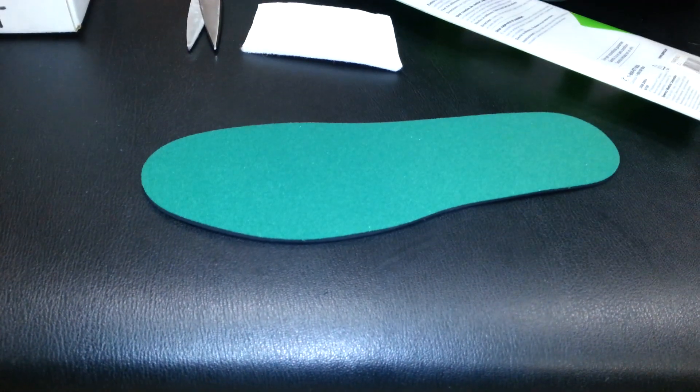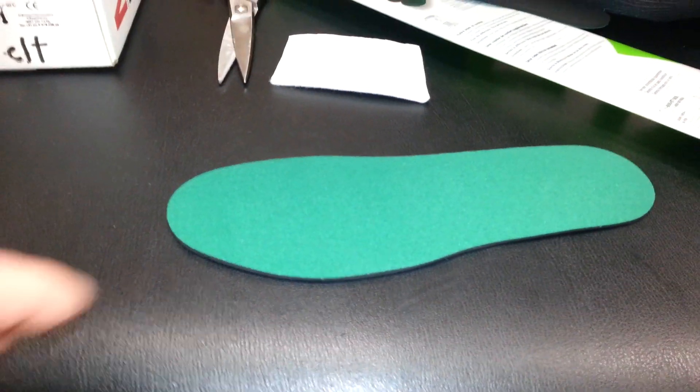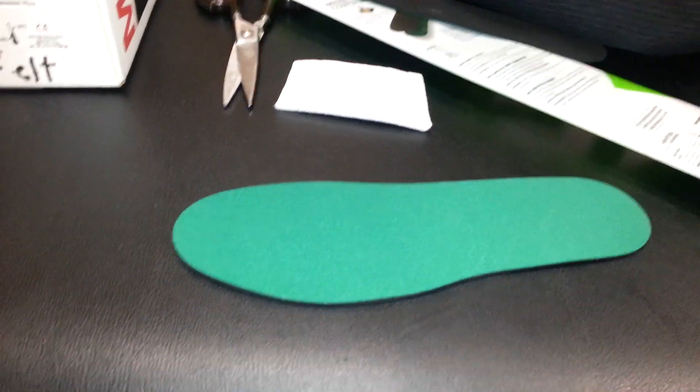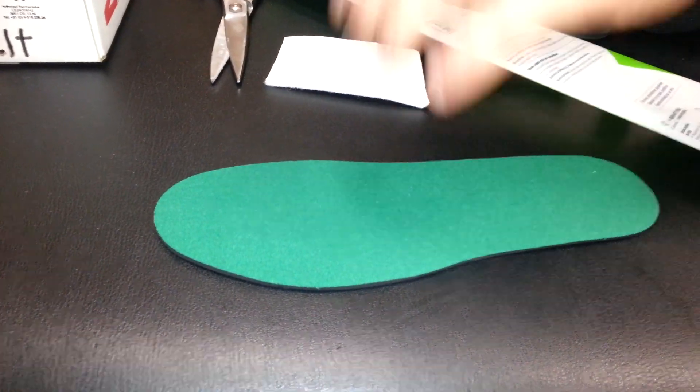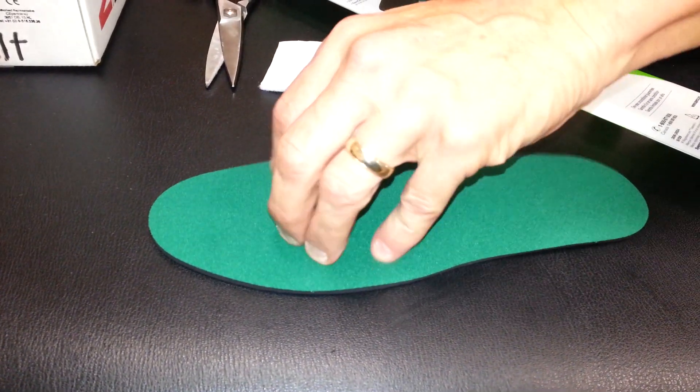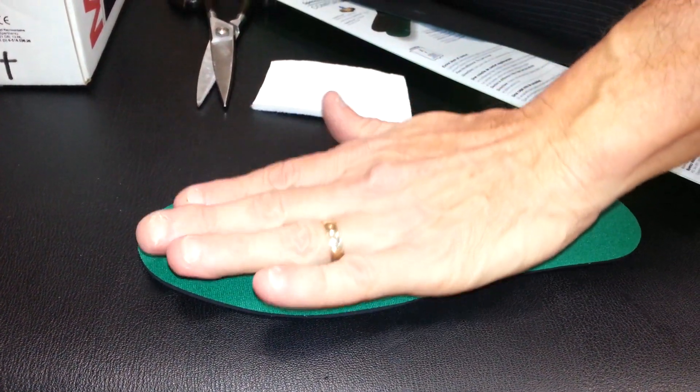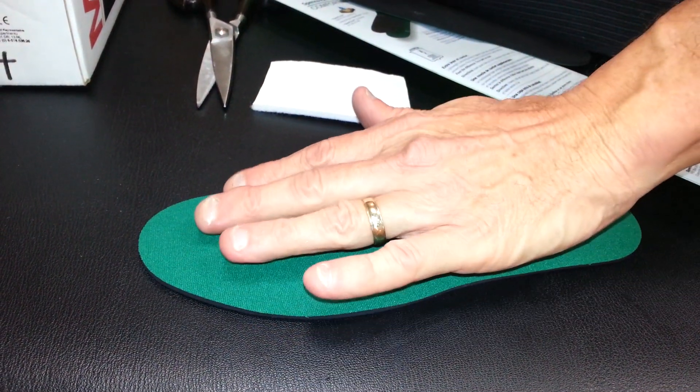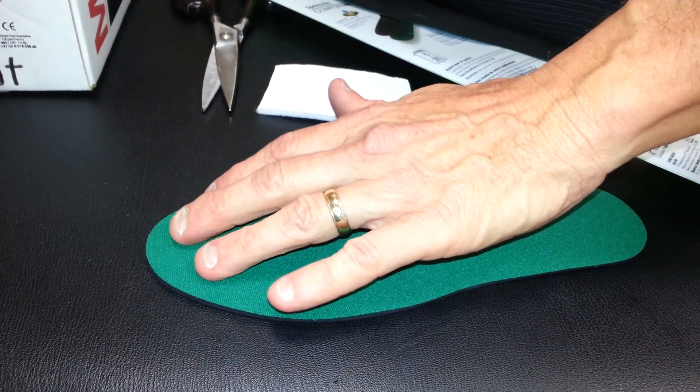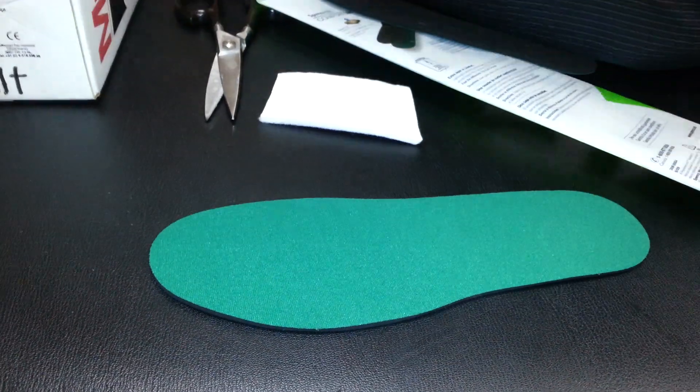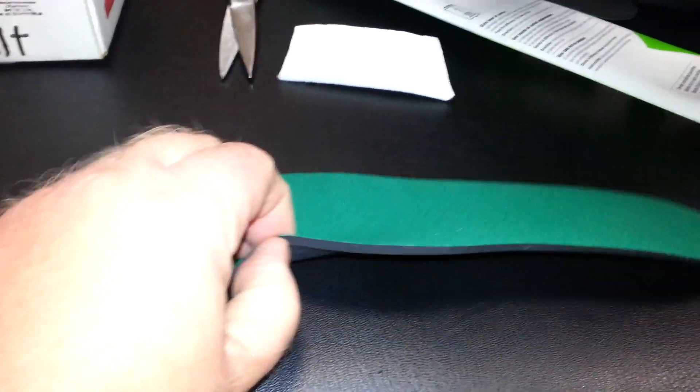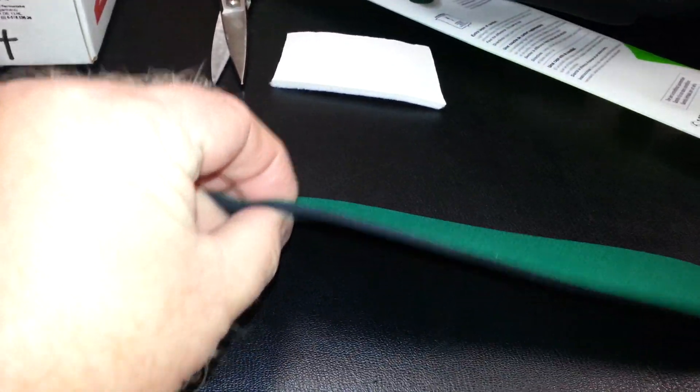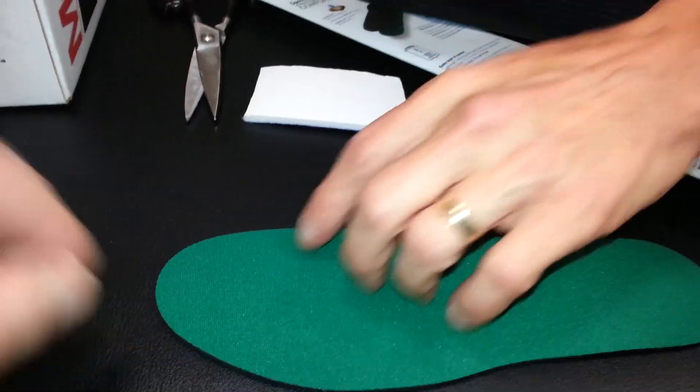Okay. So we had thought of this before with insoles, but just cutting out the piece, but not adding any padding. Yeah, adding the padding would be better because that would guarantee that that big toe's not going to get much pressure. Yeah, and that's what's the problem. Plus, these things squish so much you're not holding it up very much anyway.